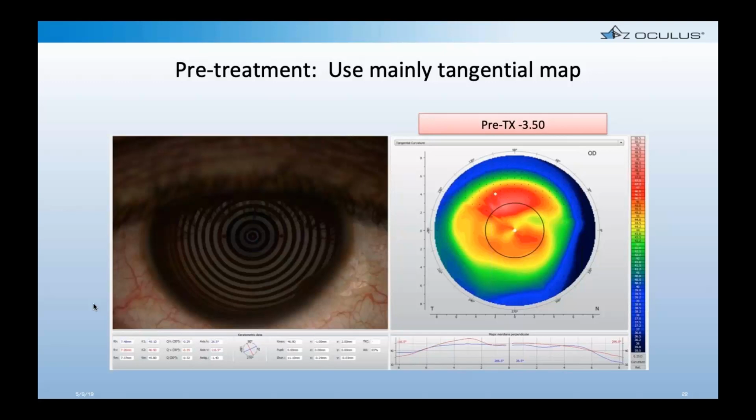This is not a child. This is actually a 30-year-old graduate student here who, through his graduate program, continued to become more myopic each year. Kind of a late bloomer, if you will, from a myopia perspective, and somebody who was concerned that his eyes kept getting worse every year, even though he's pushing 30 years old. One of our other clinicians at the school recommended he maybe consider Ortho-K as a myopia control, even though he's not a child, but just to control his myopia.